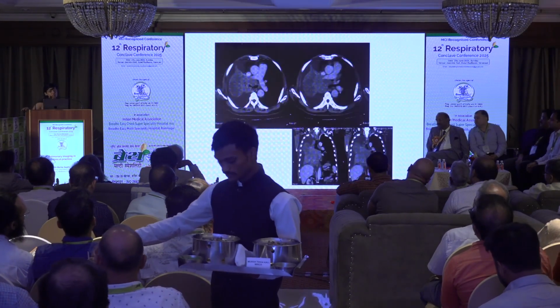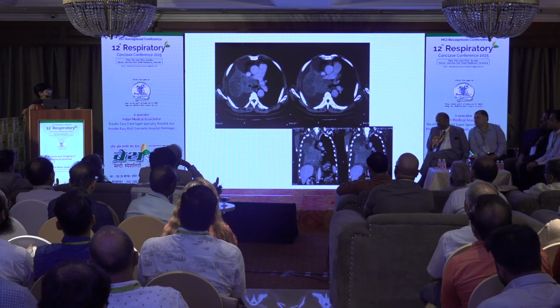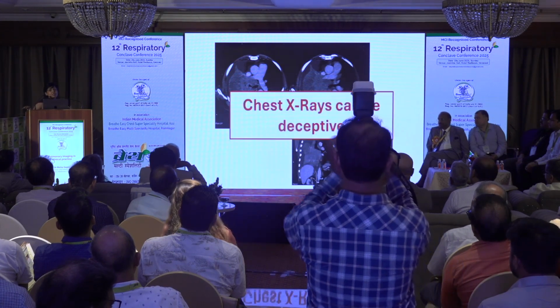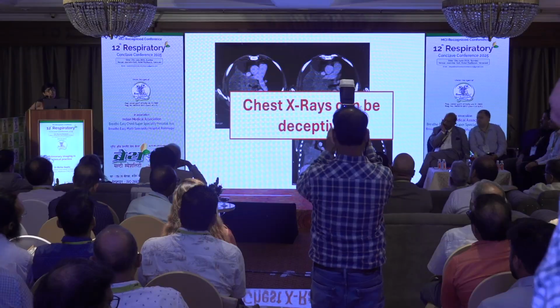And so the CT shows this. There is a large mass and there is an effusion as well. So do you agree that chest X-rays are good, but chest X-rays can be deceptive, right? Actually there is much, much more that we can see. Let's look into another case.